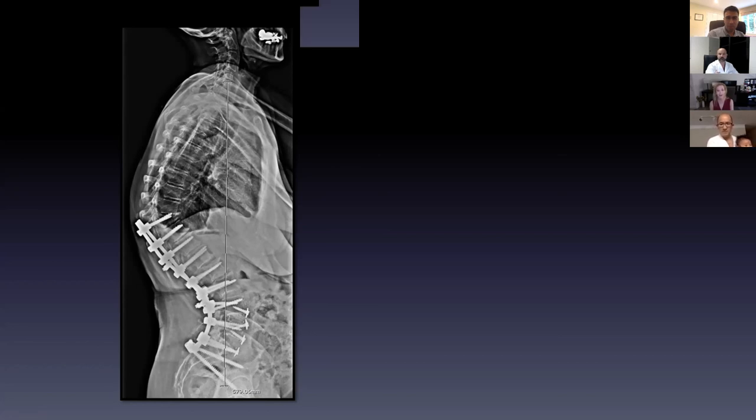Okay. Well, there's infection there. I'd say she's close to 30 to 40 degrees of kyphosis over there, and that's clearly unstable. I'd want to get a CAT scan before I would do surgery, but she needs to be extended up superiorly, probably to T4. She probably has horrible bone quality, too, it looks like on the x-ray.